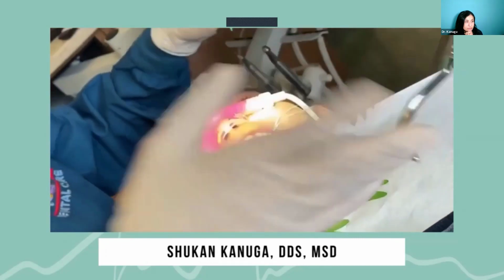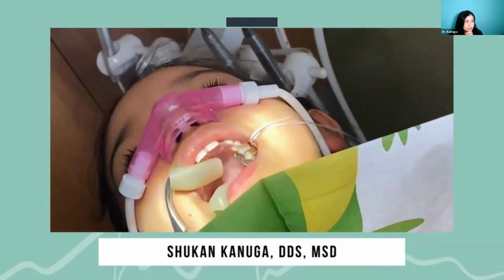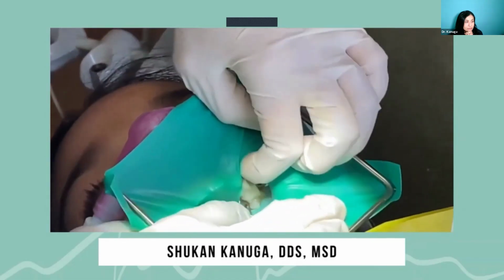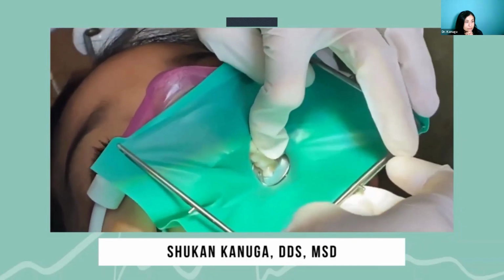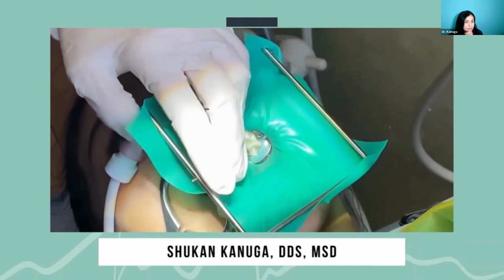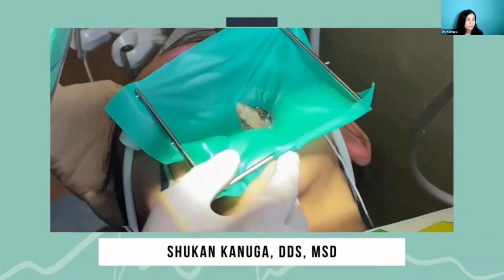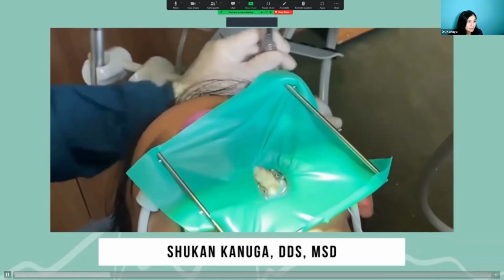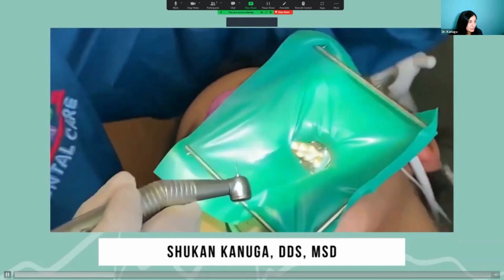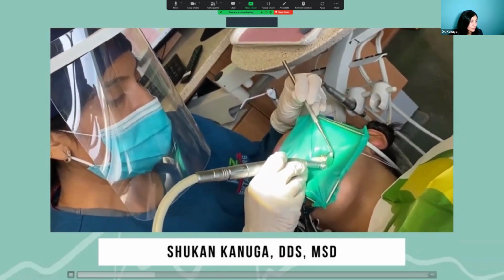Is it nice and tight there? Yeah, perfect. I can see you're enjoying the little movie you're watching. And this is my raincoat. You'll hear a lot of stretching, okay? Stretchy stretch. And this is what's going to keep everything nice and dry so you don't swallow any water or sugar bugs when I'm brushing your tooth, okay? Perfect. We're ready to rock and roll. Your head up, honey. And I'm going to start brushing your teeth with a special toothbrush, okay? If anything ever bothers you, gently raise that hand and I'll stop, okay? Perfect.